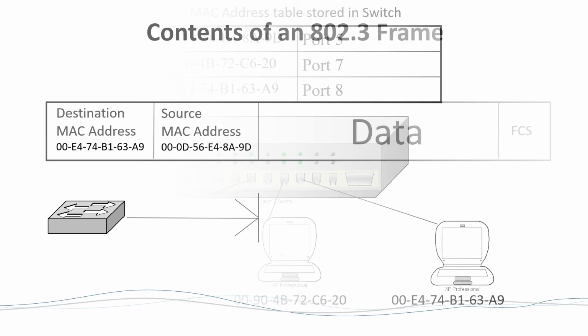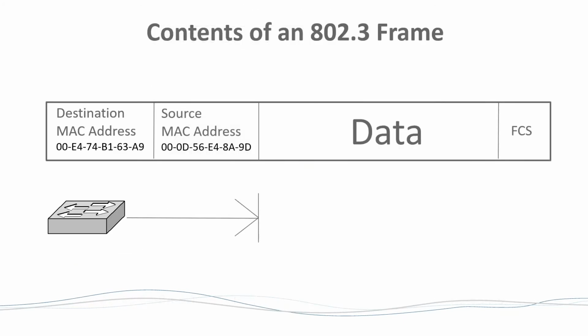It also puts in, go back, sorry. It also puts this in right here. This is a checksum. A checksum is a mathematical function that you can run on a piece of data, and it gives you a value that's unique at the end of the data.